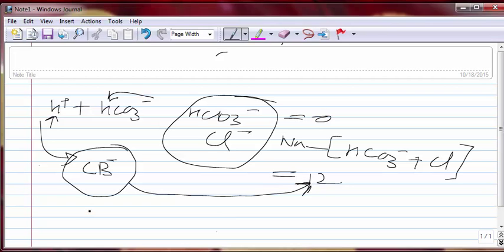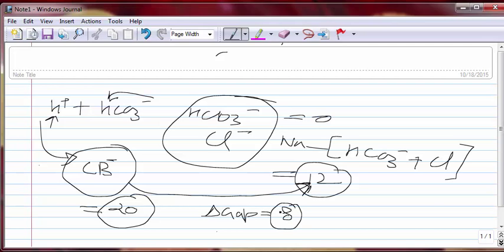So for example, if somebody's anion gap, considering his albumin is 4, is 20, what does it mean? Let's see. The normal anion gap would be 12. Now he is having an anion gap of 20. So that means there is a gap, also known as delta gap, of 8. It means that there are 8 negatively charged ions circulating in the body, which are contributing to the increased anion gap.